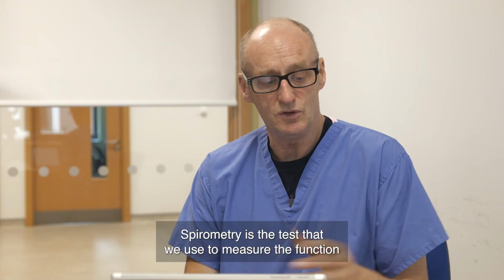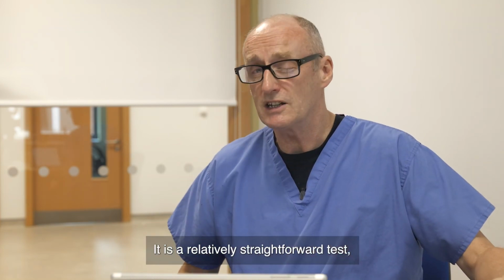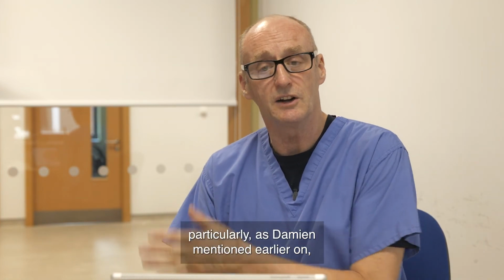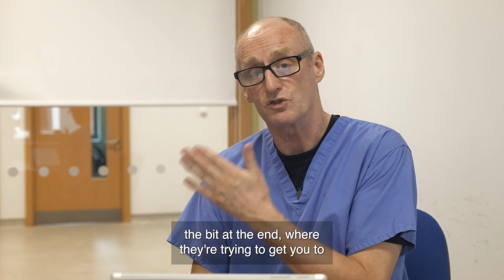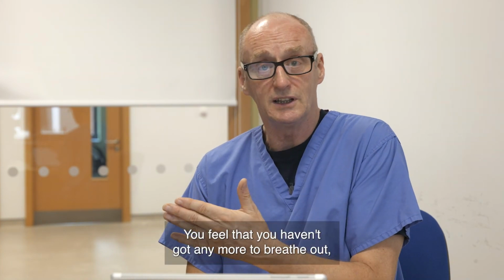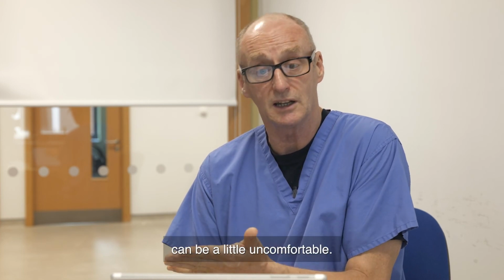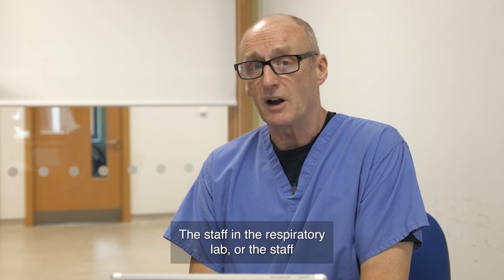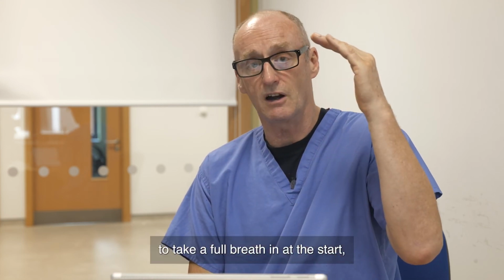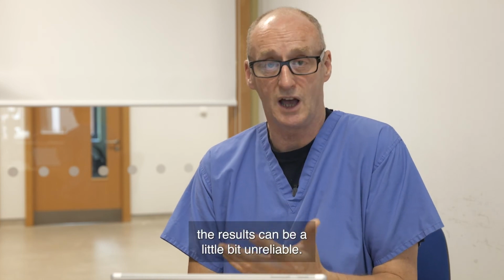Spirometry is the test that we use to measure the function of the airways, the breathing tubes. It is a relatively straightforward test, although some patients do find it a little uncomfortable, particularly as Damien mentioned earlier on, the bit at the end where they're trying to get you to absolutely empty the last bit of air out of your lungs. You feel that you haven't got any more to breathe out, but there is a little bit left. And that bit of being pushed at the very end can be a little uncomfortable. The staff carrying out spirometry absolutely have to get you to take a full breath in at the start and to absolutely empty your lungs out at the end. Because without doing that, the results can be a little bit unreliable.